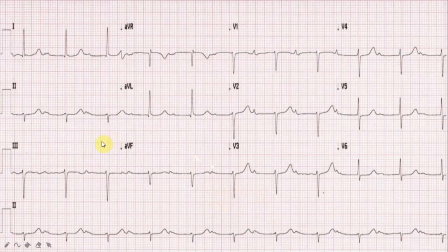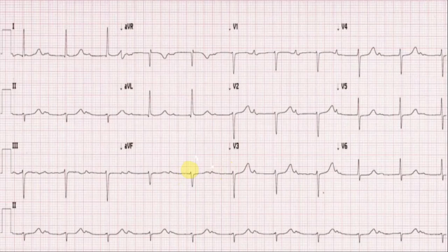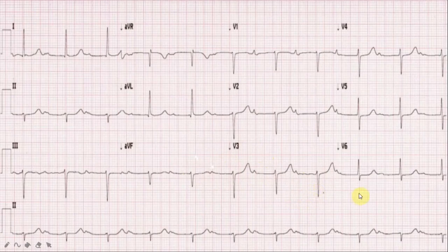Let's do another one. This is a 72-year-old patient coming in feeling very unwell and very dizzy. We did this ECG and this is what we found. Becky, please interpret this ECG for us and enlighten us with your knowledge.